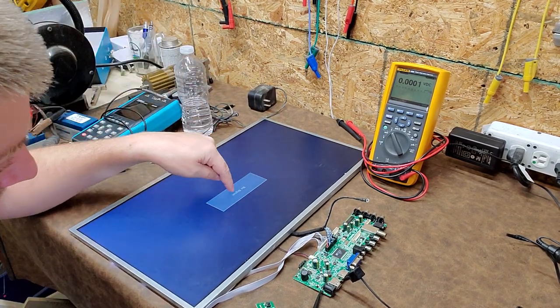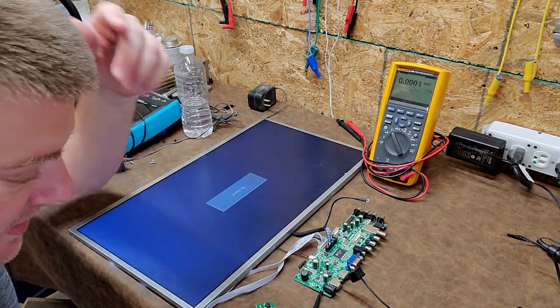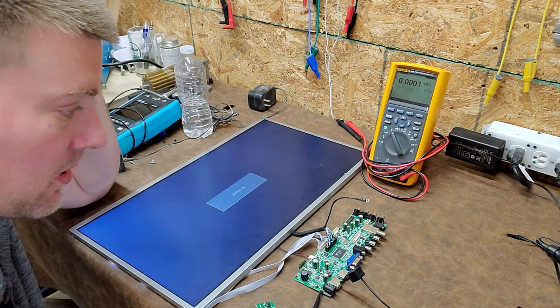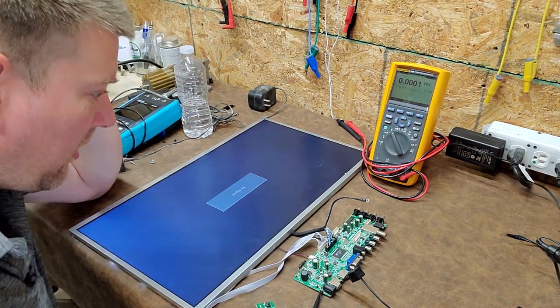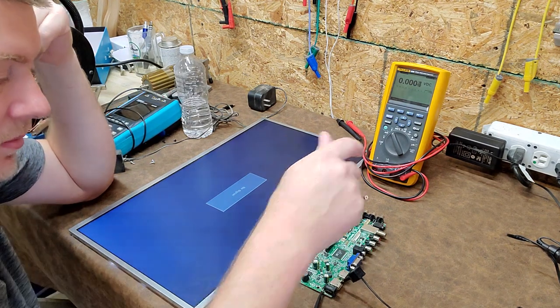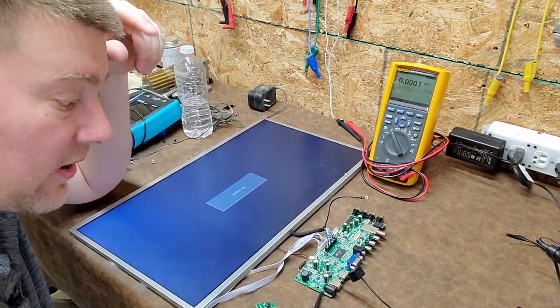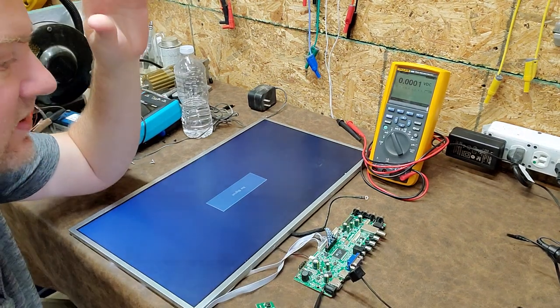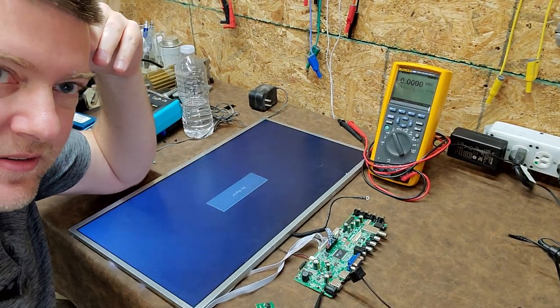And it's got a no signal, which means that it is talking to your display controller. So I would like to think that this guy is functioning perfectly well. I think all I gotta do now is throw a signal on it and check it out. So this here is just one of those things I got to tell you guys.